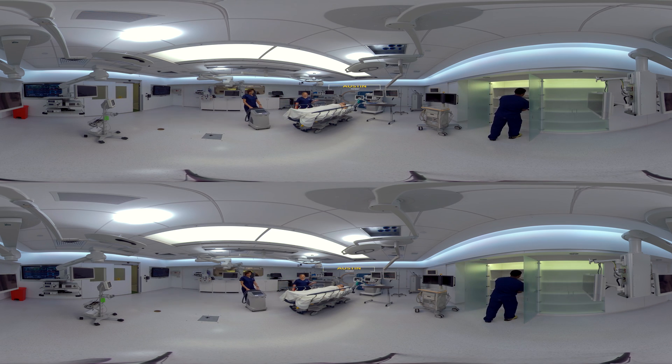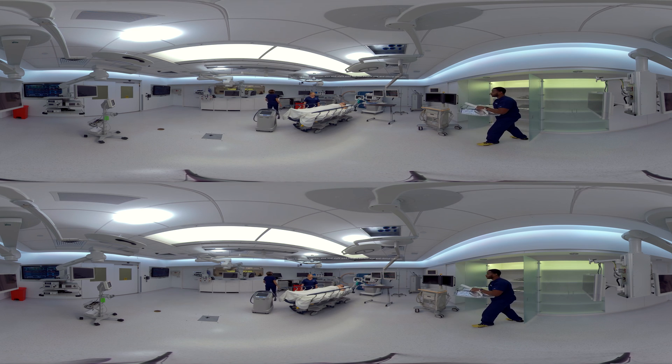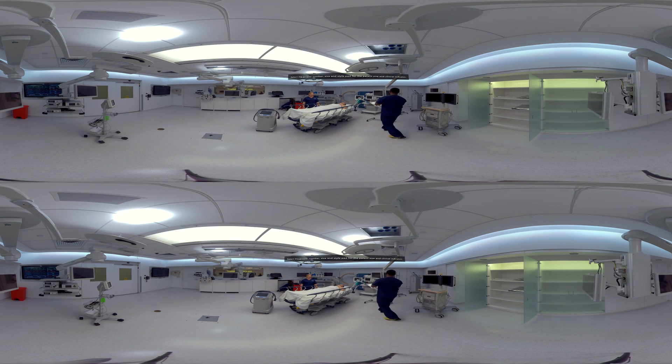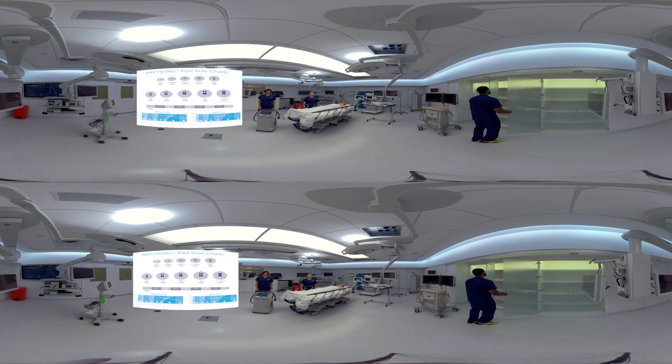This is our patient, Austin. He's already been identified as a candidate for targeted temperature management. We're going to choose size large Arctic gel pads for Austin based on his height and weight. You can see the size chart on the front of the Arctic gel package or hanging from your device.